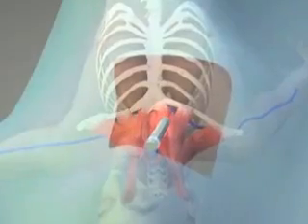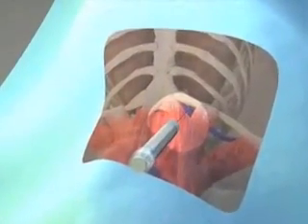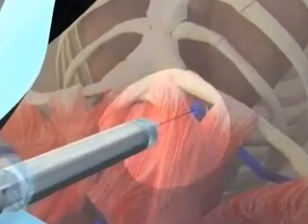This video will demonstrate the placement of a central venous catheter in the internal jugular vein with the use of one of several variations of the Seldinger technique. An additional video on subclavian line placement will be forthcoming.